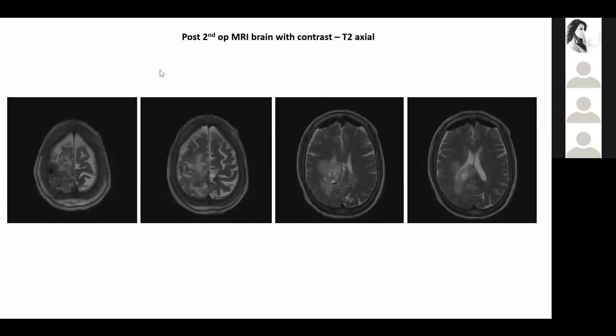Can I know what is the time interval between surgery and this scan? What is the exact timeline you people follow for post-op MRI? Is it an immediate post-op MRI or a delayed one? Dr. Shumala, we do it within first 72 hours, and most of the scans were done in 24 to 48 hours. Okay. It is one case, Dr. Maha? Yes, and this MRI was done, I think, within 24 hours. Okay, so we can read.